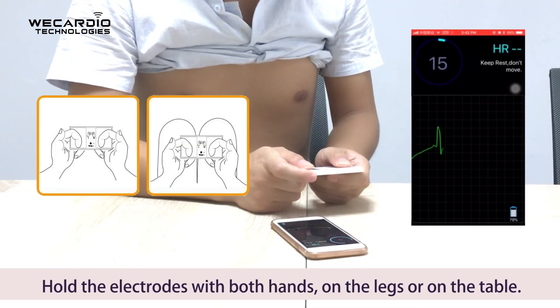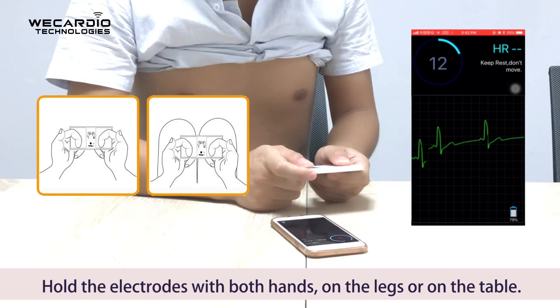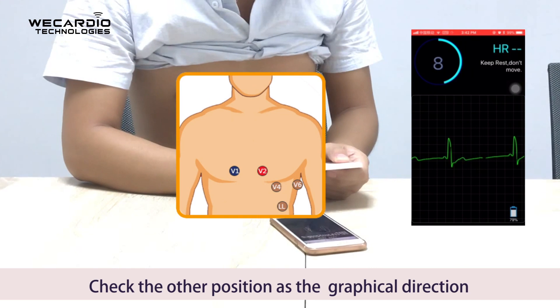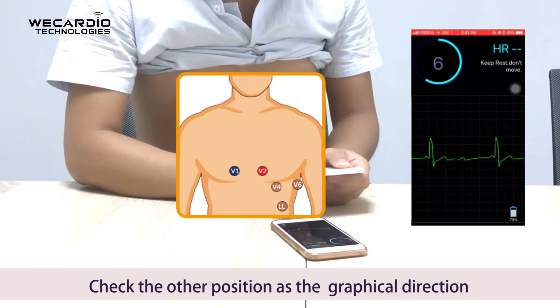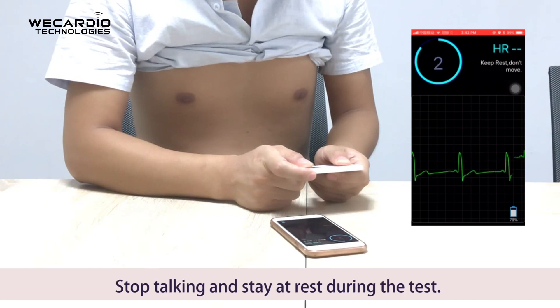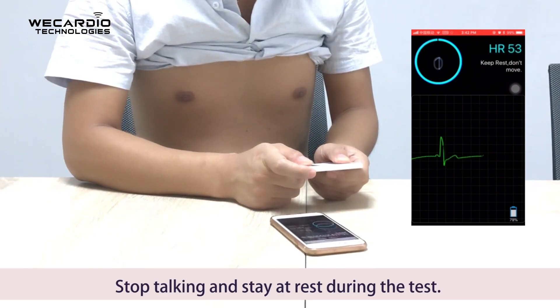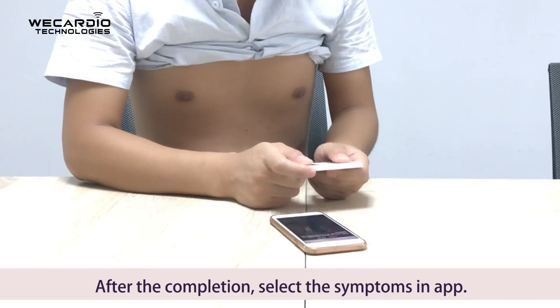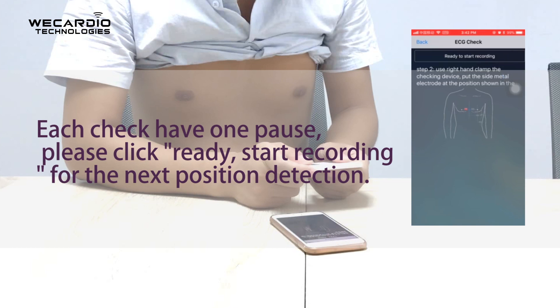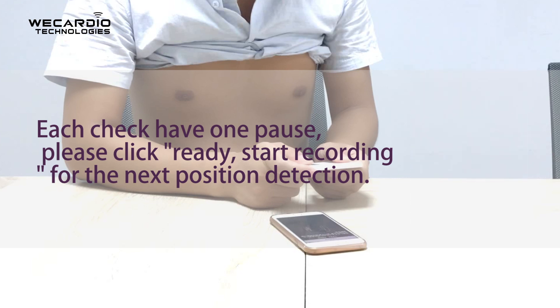Hold the electrodes with both hands, resting on the legs or on the table. Check the other positions as indicated by the graphical direction for different device positions. Stop talking and stay at rest during the test. After completion, select the symptoms in the app. Each check has one pause — please click 'Ready' to start recording for the next position detection.